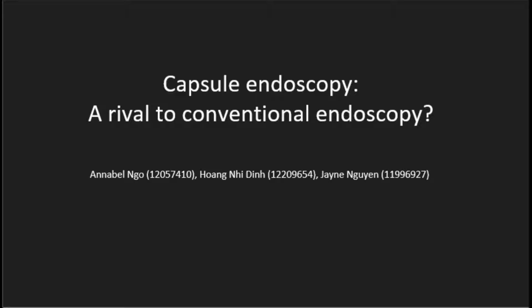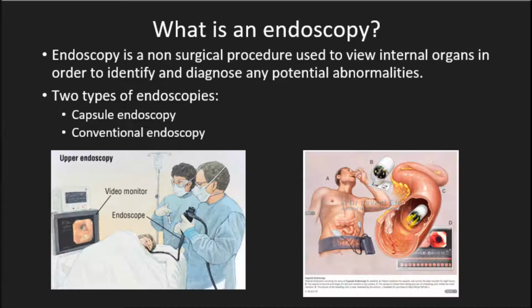Capsule endoscopy: is it a rival to conventional endoscopy? Endoscopy is a non-surgical medical procedure performed to view the inside of hollow organs and cavities of the body, such as the gastrointestinal tract, in order to investigate, diagnose, and treat any potential abnormalities.